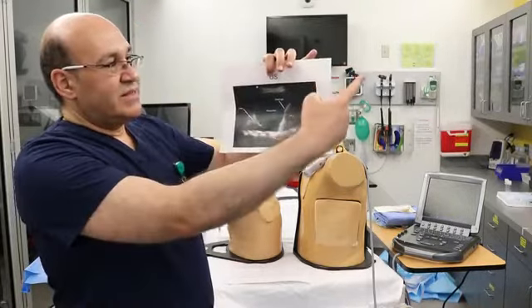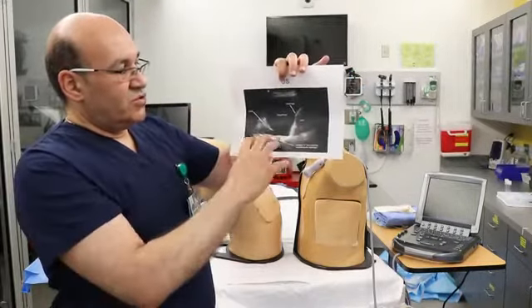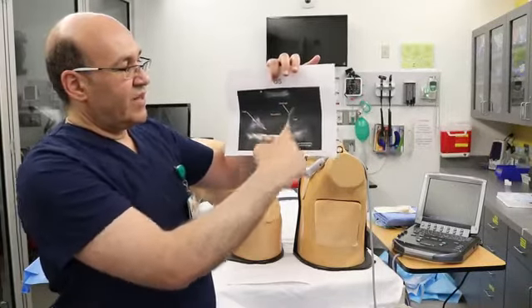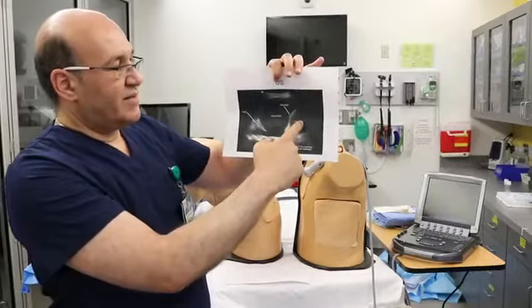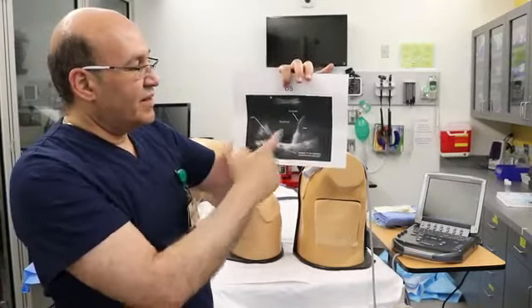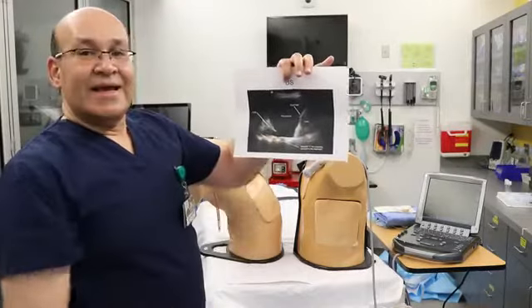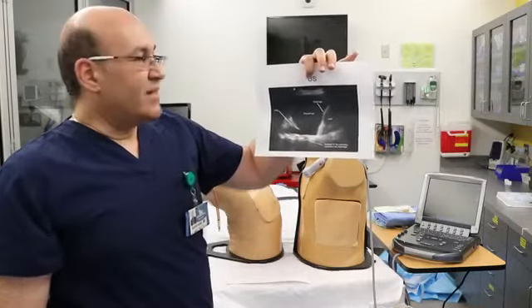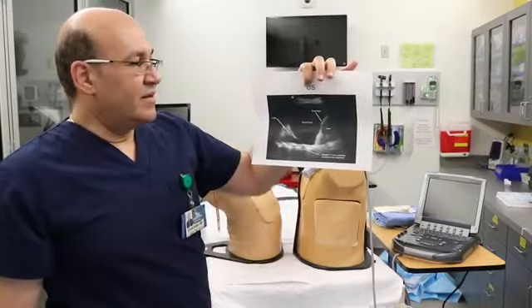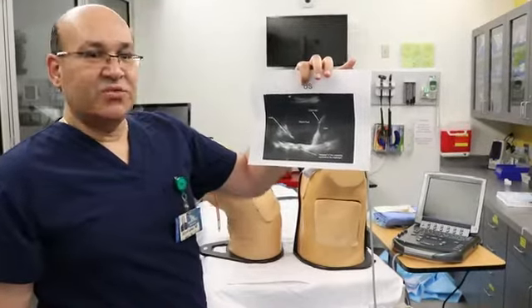Head here, legs here, your probe is here, it should be your internal organs here. This white curved line is your diaphragm. Below it will be the liver on the right, spleen on the left, and this is how the collapsed lung will look like. This fluid looks very clearly black, water is black, so this tells you that this is a free-flowing fluid, not complicated effusion. So this will be easy to get.